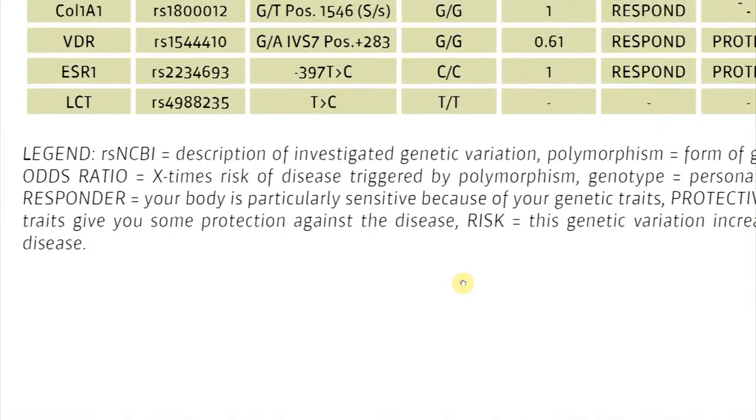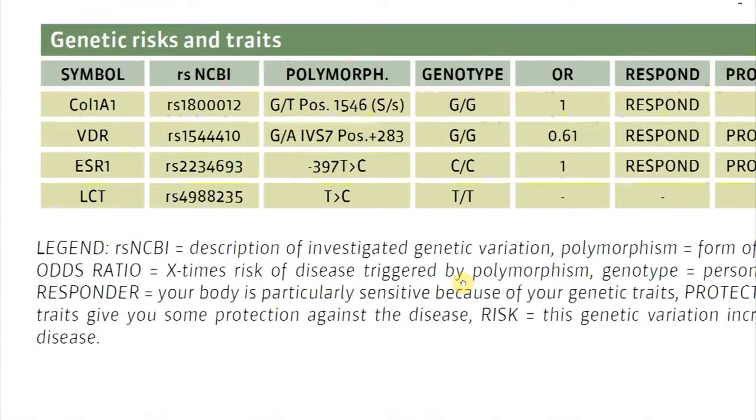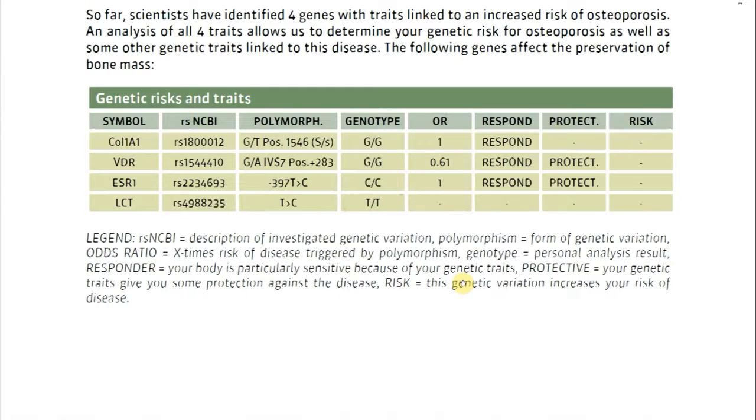Because this LCT gene that I've told you about before doesn't actually have a direct link to osteoporosis, but it is the one that causes lactose intolerance. So some people, due to this genetic variation, cannot drink milk without getting severe side effects. What we've done here is we tested this gene, and in this case it's okay.